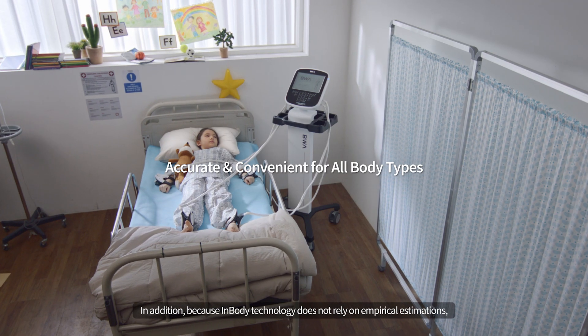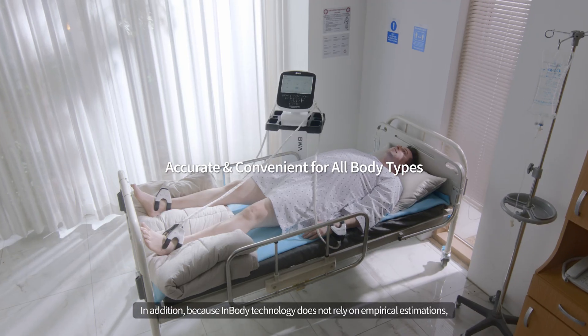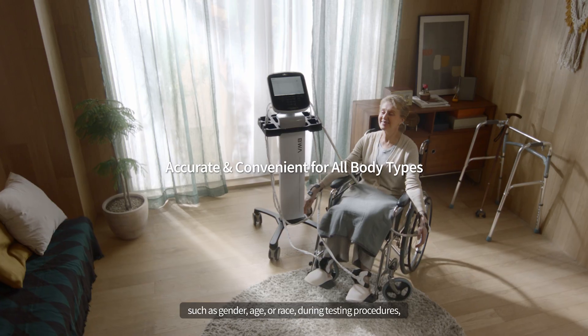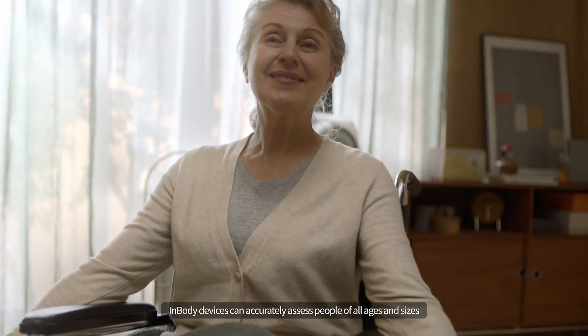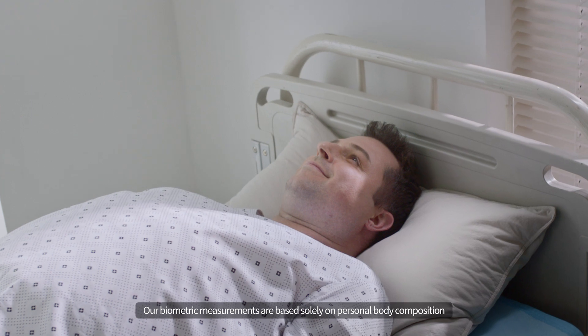Because InBody technology does not rely on empirical estimations such as gender, age, or race during testing procedures, InBody devices can accurately assess people of all ages and sizes. Our biometric measurements are based solely on personal body composition.